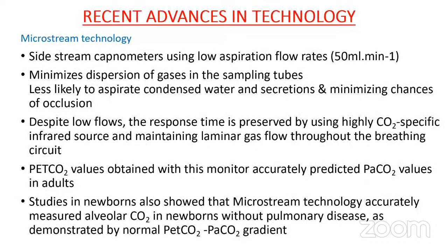Recent advances: this is the latest microstream technology, which uses side stream capnography, and this allows minimal gas aspiration, only up to 50 ml. The other one, infrared, was using 50 to 100 ml. It minimizes the dispersion of the gases in the sampling tubes, and it is less likely to aspirate condensed water and secretions. Despite the low flow, the response is good here, and ETCO2 values obtained with this monitor accurately predict the PaCO2 values in adults. It can also be very useful in pediatric patients where the volume we are using is very less.